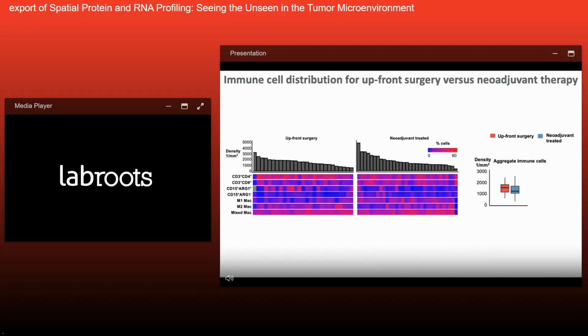Having documented our findings in tumors from upfront resections, we turn to neoadjuvant treated cases. To control for confounding due to variable tumor response to treatment, we only studied cases where all tumor and slides were available for review, allowing us to both uniformly grade tumor response and to select the most representative blocks from neoadjuvant treated cases for analysis.